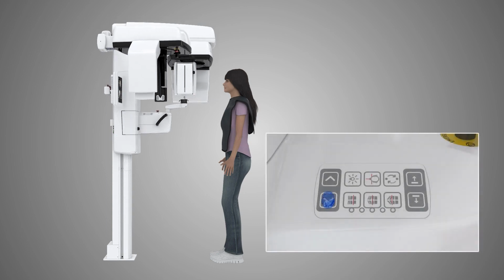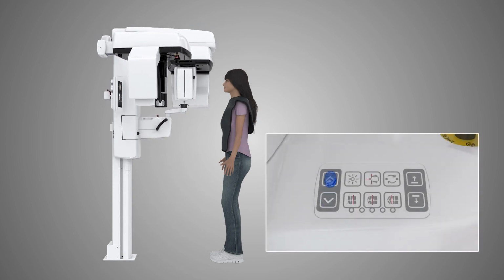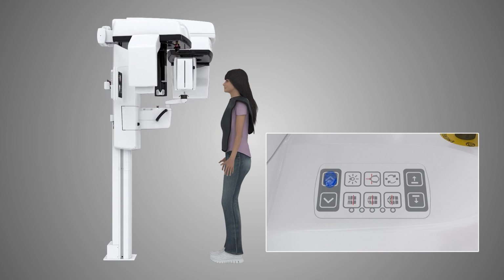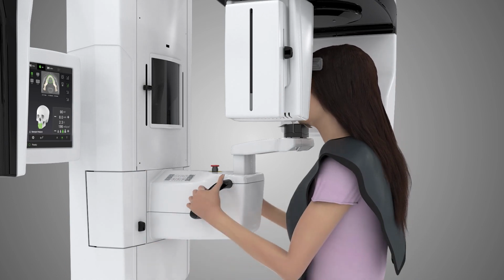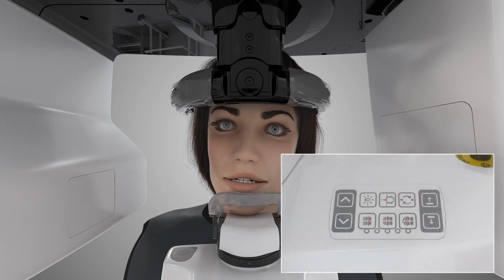Adjust the unit's height using the up and down arrows on the positioning panel. Move the unit so that the chin rest is level with the patient's chin. Ask the patient to step forward to grip the handles and place their chin on the chin rest. To check the patient's head position, press the laser light button on the positioning panel.